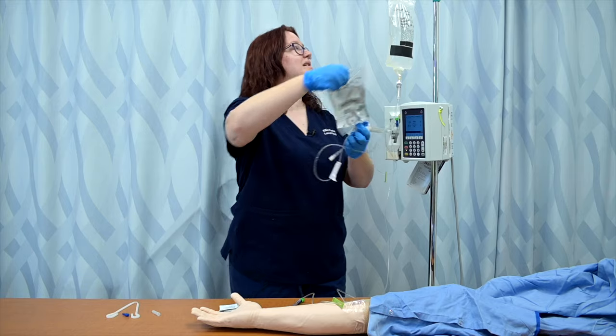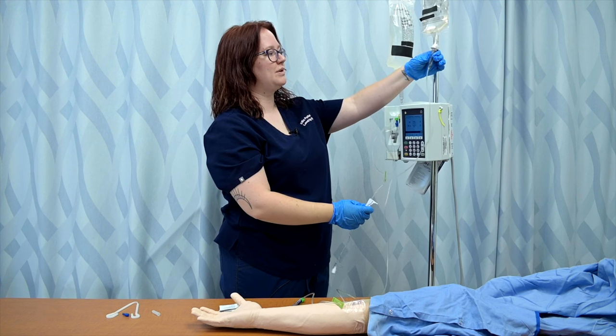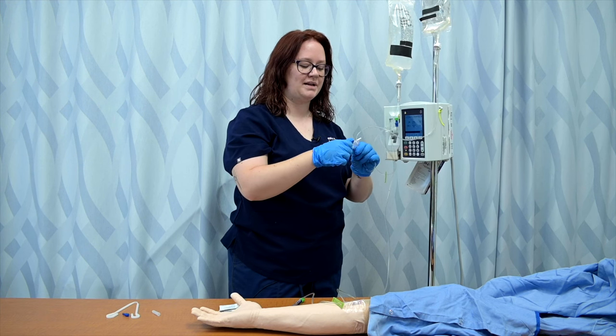I can now hang my secondary bag on my pump. I'm going to squeeze this drip chamber until it's about half full. And then I'm going to take the end cap off my secondary tubing.